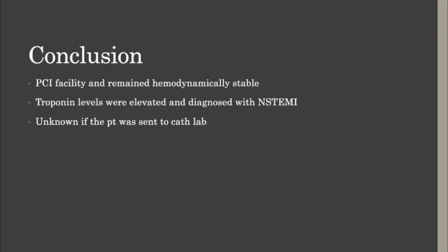The hospital elected to monitor the patient for a period of time, and it's unknown if the patient went into the cath lab. And this is going to wrap up our case study.